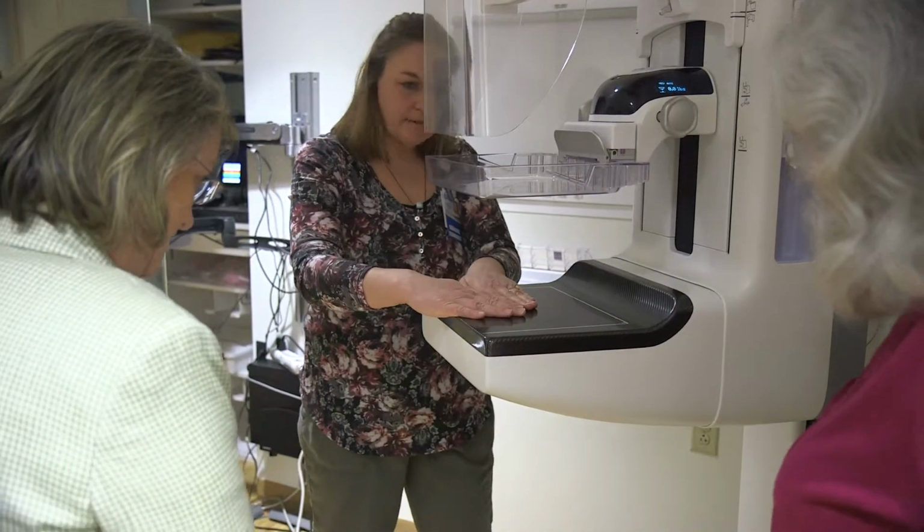In order to understand how that happens, let's talk about how a 2D mammogram works. For a 2D mammogram, we compress the breast one way and take a picture from the top. And then we compress the breast another way and take a picture from the side. So a 2D digital mammogram is two pictures of each breast, one from the top and one from the side. As we already know, the breast has a mix of fibroglandular and fatty tissue. The fibroglandular tissue shows up as white on a mammogram, and cancer also usually shows up as white on a mammogram. This can make finding cancers a challenge.